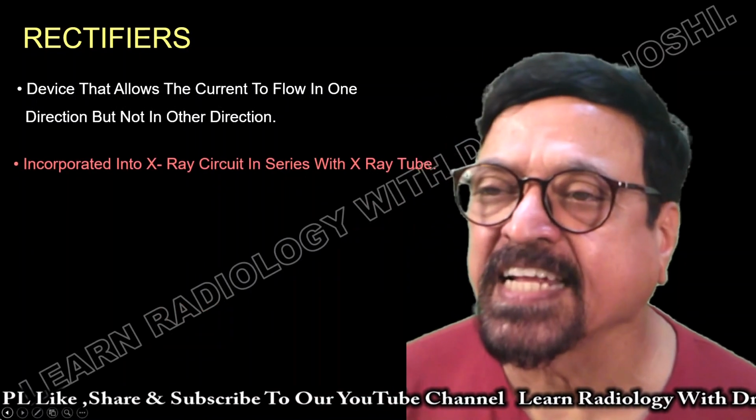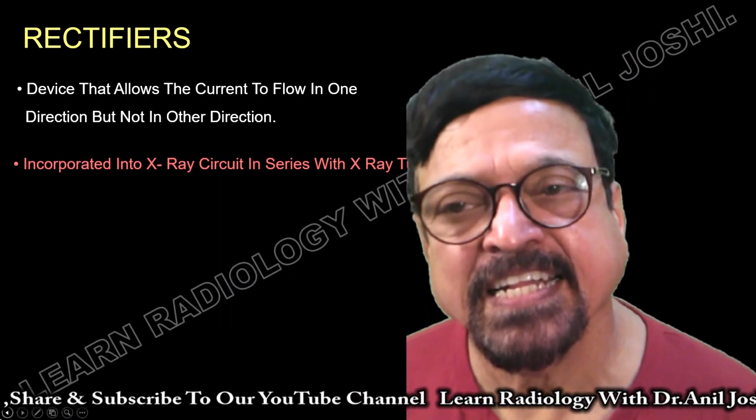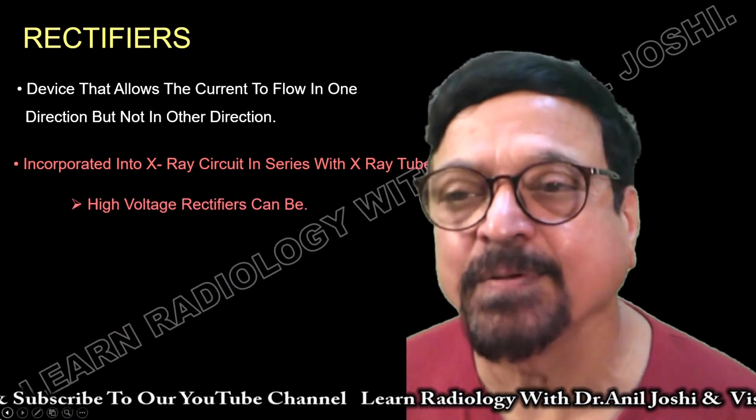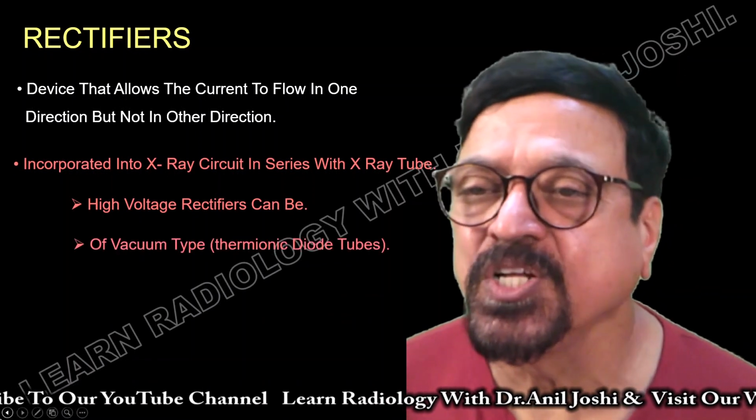Incorporated into the X-ray circuit in series with a tube. You will find that they have to be in the X-ray circuit in series, not parallel. They have to be in series. So high voltage rectifiers can be used.